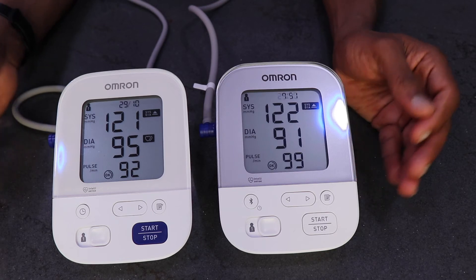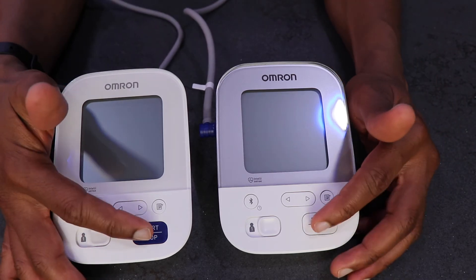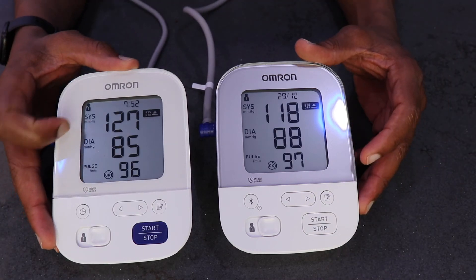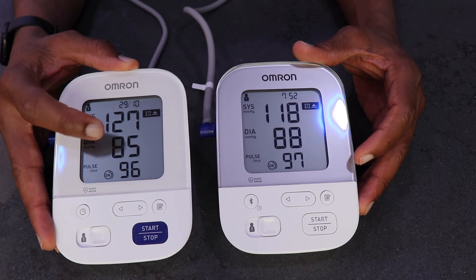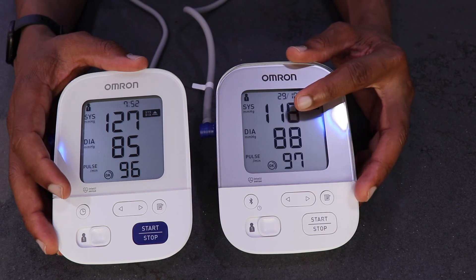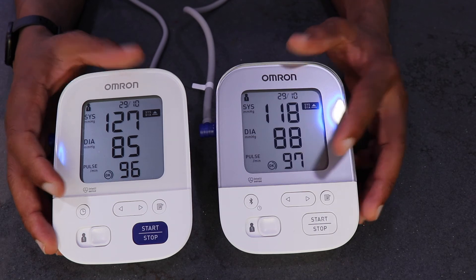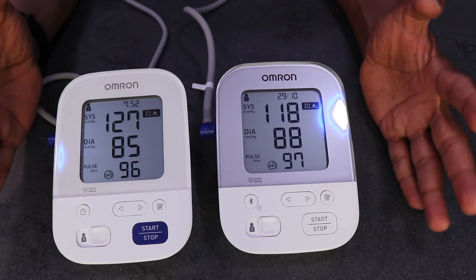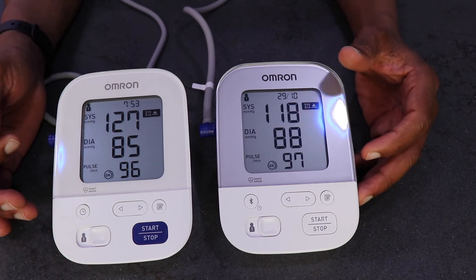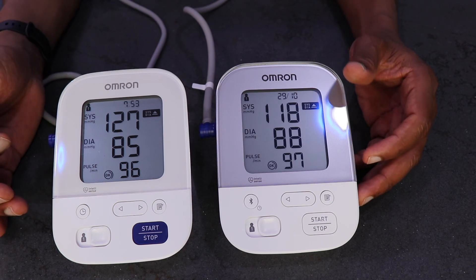There is not much of a difference there. For the second reading, the right arm says 127 over 85 with a pulse of 96, and the left arm says 118 over 88 with a pulse of 97. There is not much difference again — slight variation in the systolic readings, but the diastolic and pulse are almost the same.